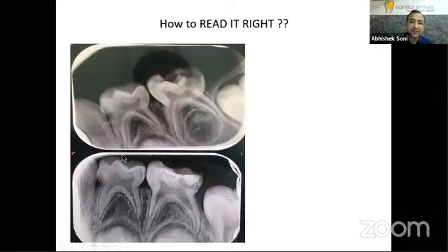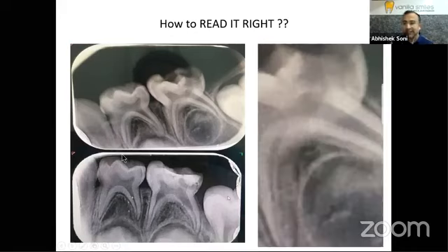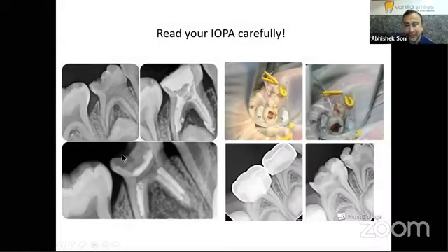For a 6 or 7-year-old, you may have to start with your 15K file, your 20K file, which is 2%, and then gradually move on to 4%. In your radiographs, the most important area is your interradicular area, wherein you have to check for any radiolucencies, if any, and then eventually decide whether the tooth needs a pulpectomy. Because of the accessory canals, the furcal region is the first area where you will start seeing your radiographic changes. So if you see in the left radiograph, there is furcal radiolucency, which is suggestive that the child needs a complete root canal or pulpectomy treatment.